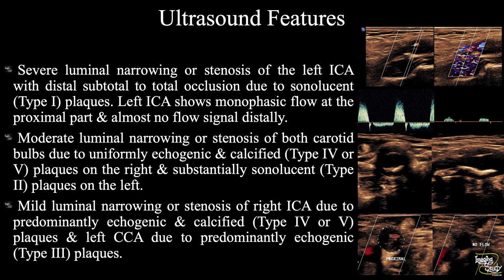In summary: severe luminal stenosis of the left internal carotid artery with distal subtotal to total occlusion is noted due to sonolucent Type 1 plaque. The left ICA shows monophasic flow proximally and almost no flow signal distally. Moderate luminal stenosis of both carotid bulbs is seen — due to echogenic calcified Type 4 or Type 5 plaques on the right side, and substantially sonolucent Type 2 plaques on the left. There is also mild luminal stenosis of the right internal carotid artery due to predominantly echogenic calcified Type 4 or 5 plaques, and of the left common carotid artery due to predominantly echogenic Type 3 plaques.